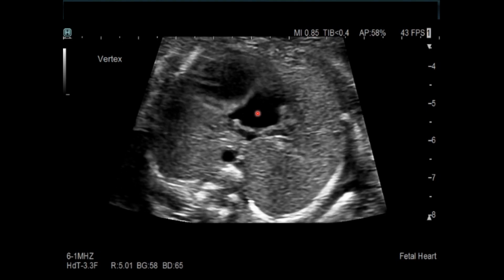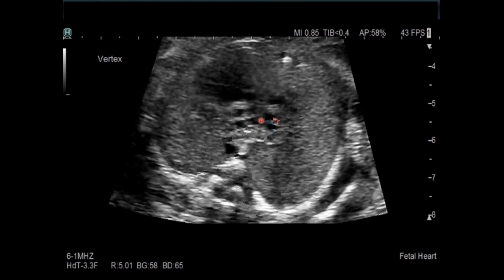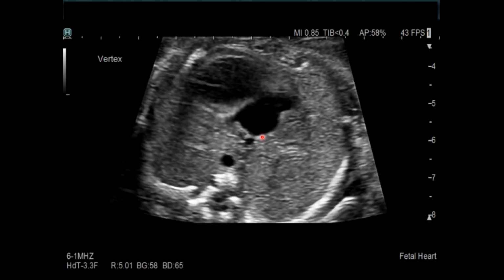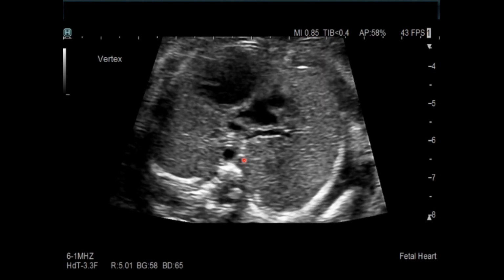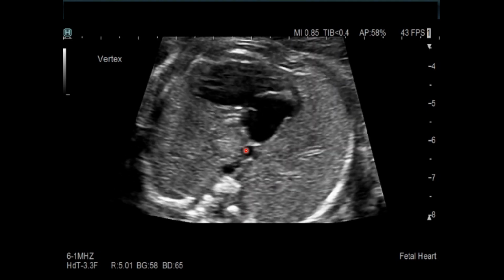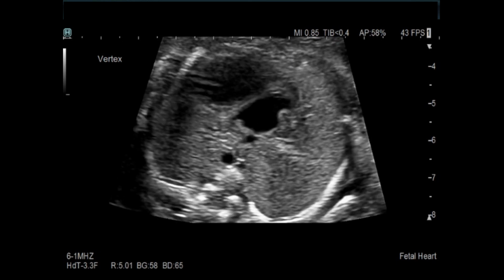We go through the bilateral superior vena cava here in the beginning. Here, pulmonary artery bifurcation, pulmonary venous confluence connecting to that vein that goes, in this case, below the diaphragm, and we will show that in subsequent images.